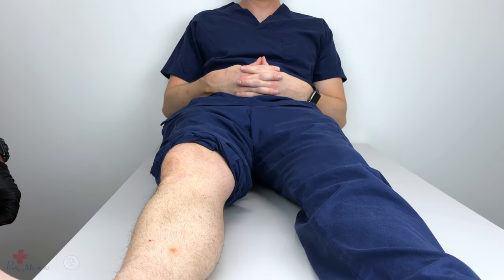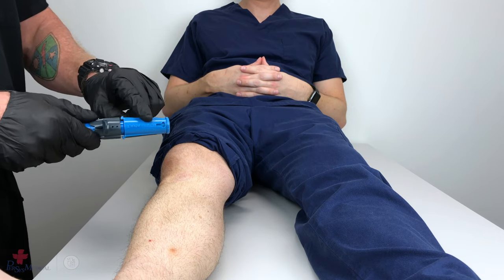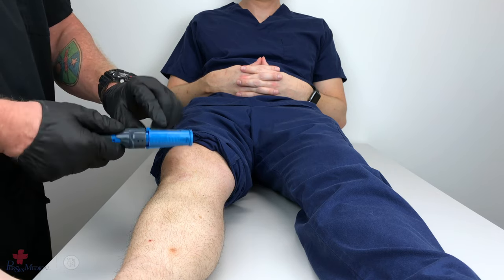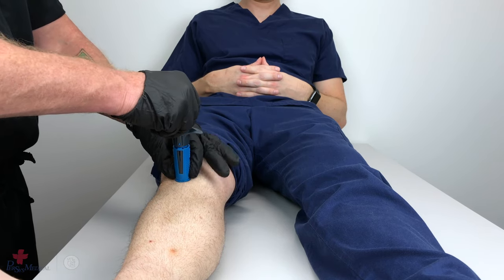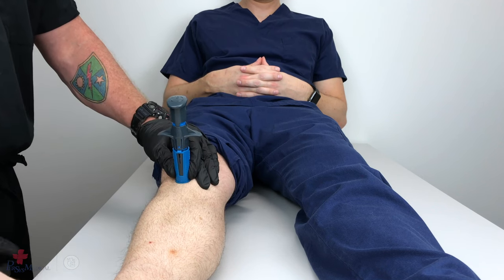Once you've properly located and prepped the site, grasp the NEO by the textured dots, taking care to not put your fingers over the stabilizer locking tabs. Grasping at the textured dots, properly emplace the NEO over the site, using the palm and fingers of that hand to stabilize the NEO in place.